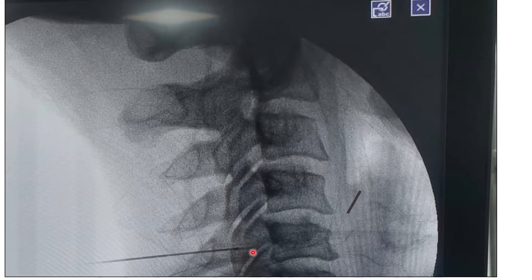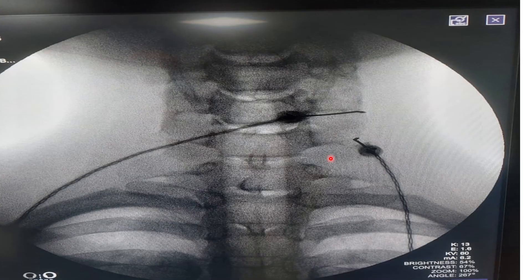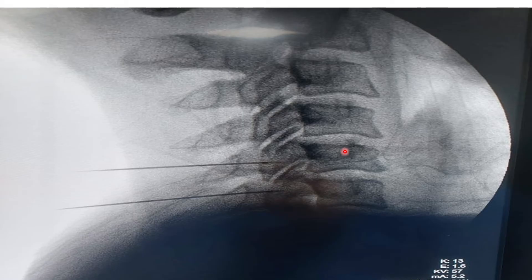I have entered inside and the tip is at the middle — now we are ready for the next needle placement. Again the needle has to be placed in the prone position using the same AP (epi) view. The waist is our target. After giving local anesthesia I have marked it. Once the needle is entered and hitting the bone, we check again in lateral view — in this lateral view this is the middle of the articular process.